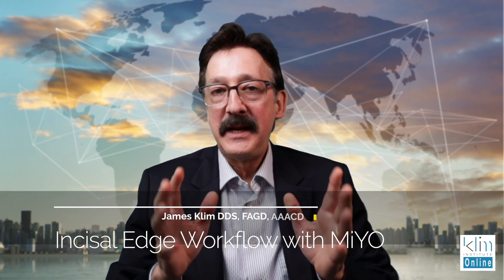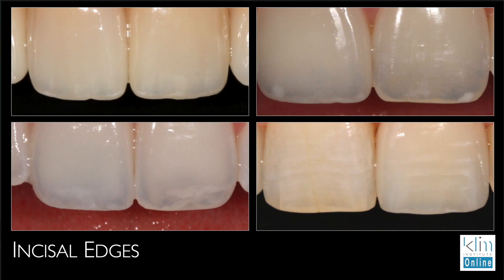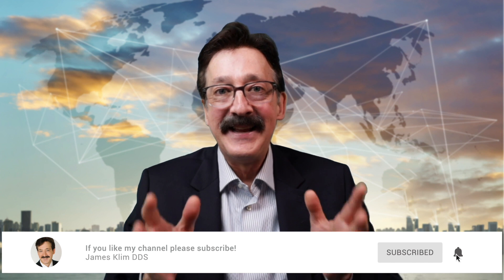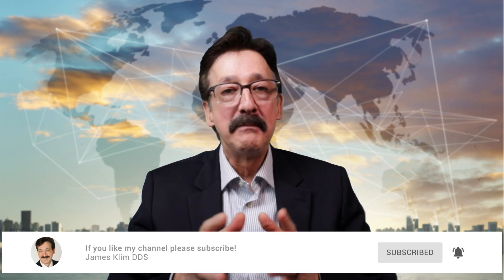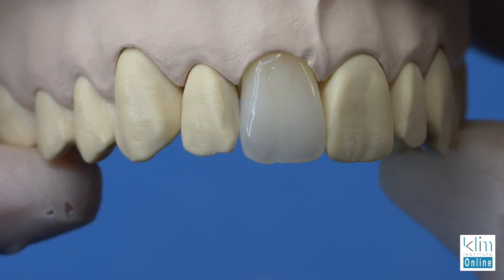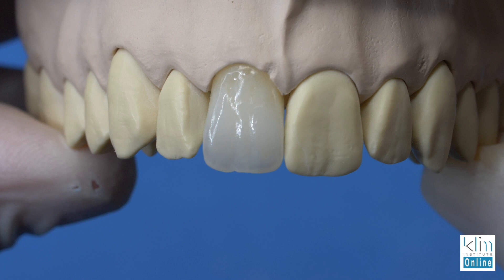I love creating incisal edge characterization. There are a lot of different ways to do it. Historically, we used to cut back and layer — I have a skill set in doing that and I love it — but I still like the strength of a monolithic incisal edge. Currently, I'm using Mio to create that incisal effect. This video is my basic workflow for creating that incisal edge that looks like a cut back, but with the monolithic incisal strength.